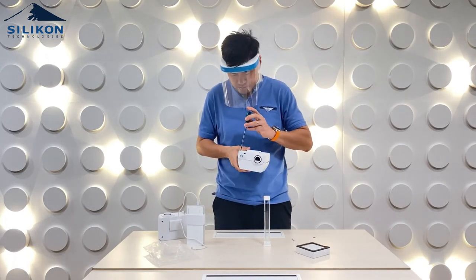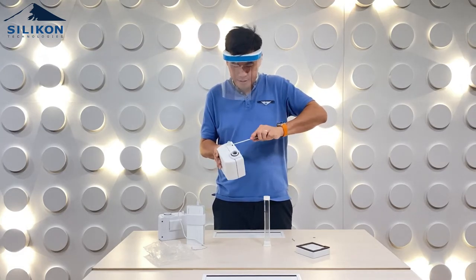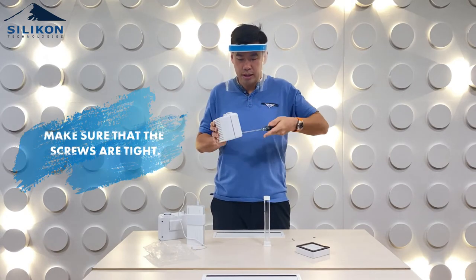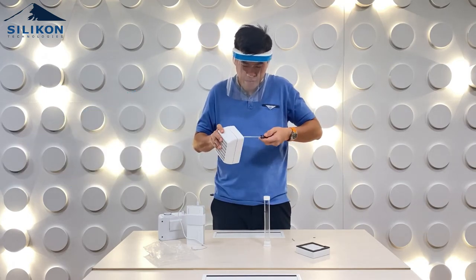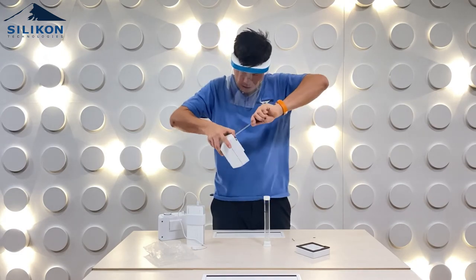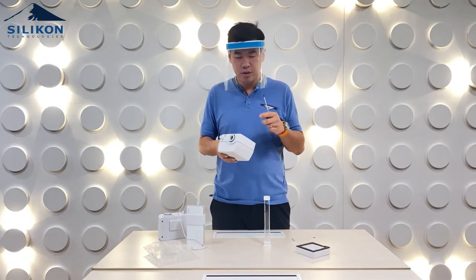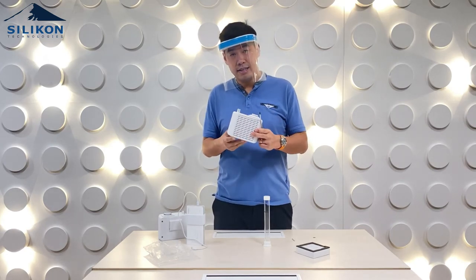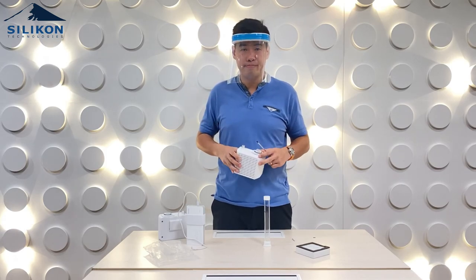Once you connect it, just screw it — it's as simple as that. Make sure you're finished with all the screws and that they're tight, so it completely seals the air cube with the filter cover. Make sure you screw all four screws tightly, and that's how easy it is to replace the HEPA filter on the air cube. Thank you.